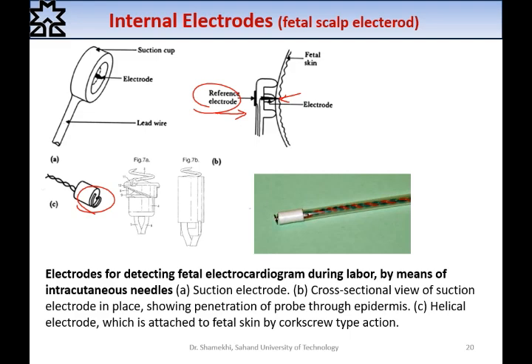These are not commonly used electrodes. Based on the order of doctors, they may use these types of electrodes to record directly the signals from the body of the fetal's scalp.